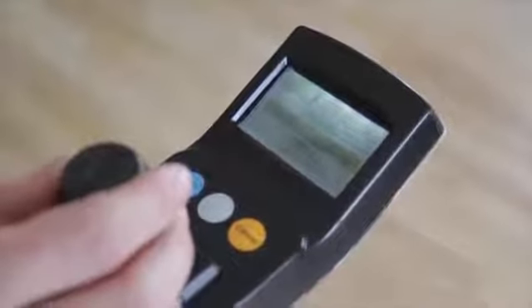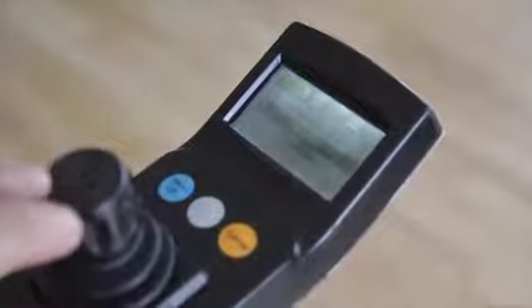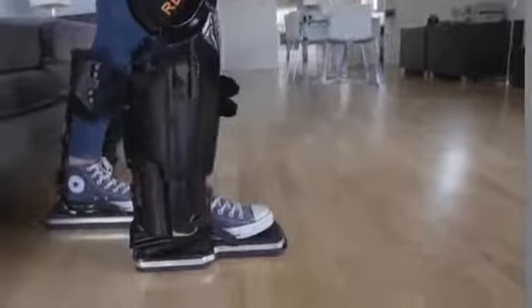There are a number of different functions that Rex can carry out. Let's start with the walking. By simply selecting walk from the list of programmed actions, I can begin to move forwards or backwards.